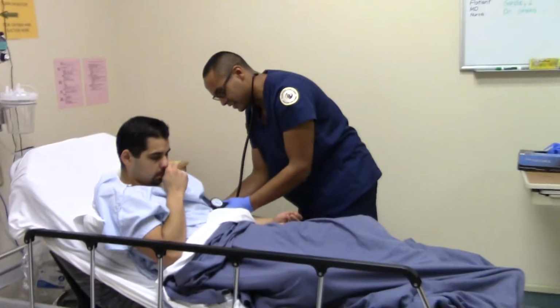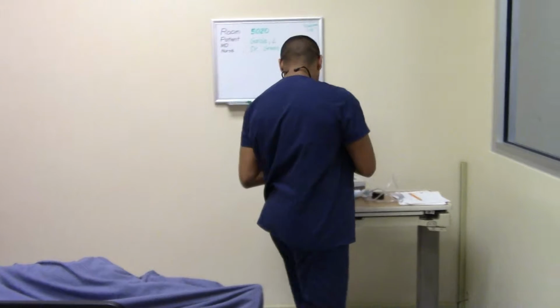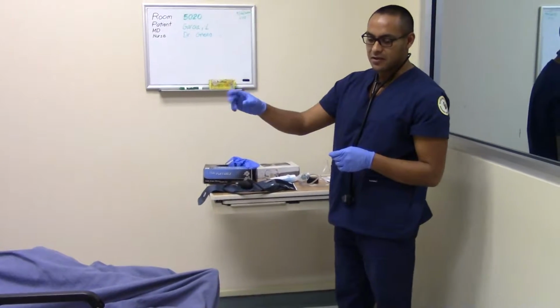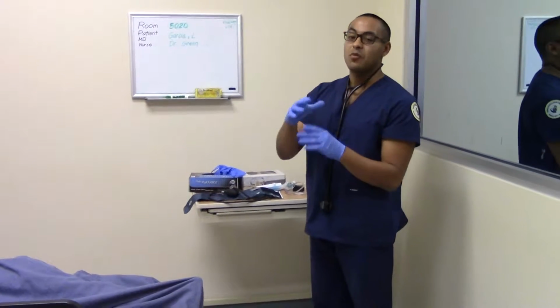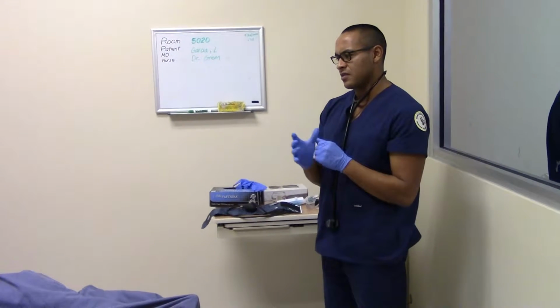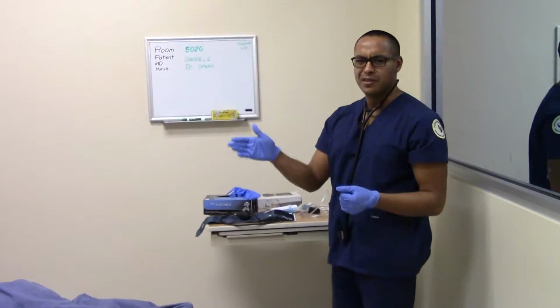Looks pretty good. And do you mind if I call you Christian? Just so you know what I saw, 120 over 75, normal. I put that in my chart. Normal is between 80 and 120, sorry, 120 to 80. Systolic 120, diastolic 80. Pretty normal, healthy patient.